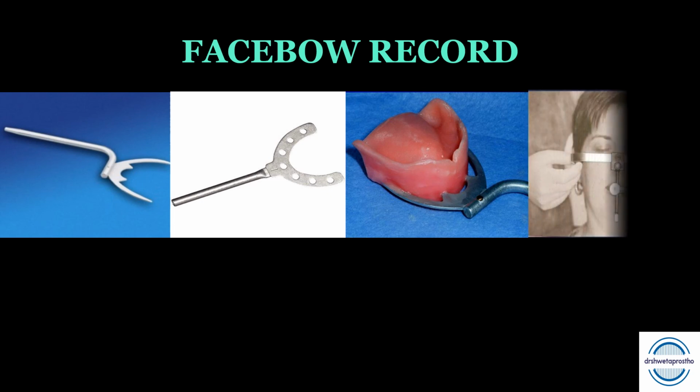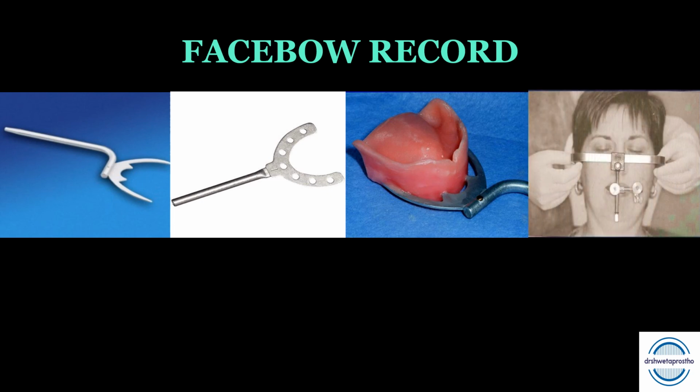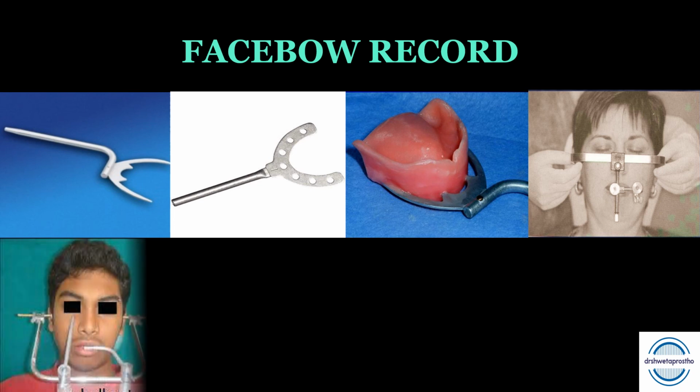With the bite fork in position, the Facebow is guided into the stem of the bite fork and then the earpiece is inserted into the external auditory openings. After this, the orbital pointer, that is the third reference point, is positioned. Thumb screws are tightened in sequence 1, 2, 3. They are numbered. This comes as an MCQ question also.